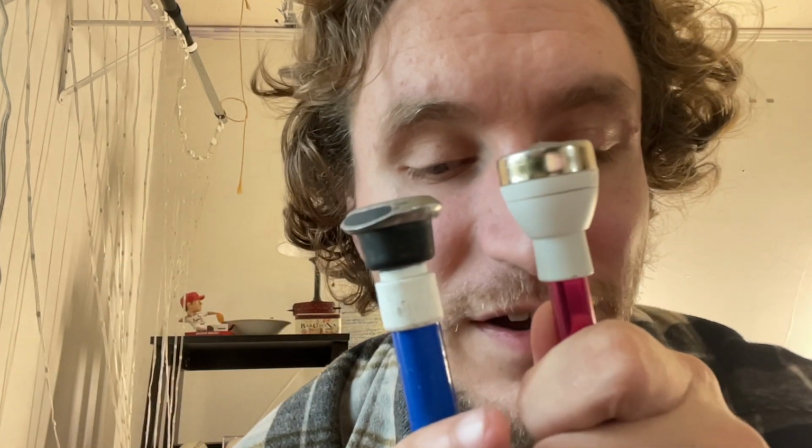So the tip on this cane is the only potential downside. And what's interesting to me is it feels, and maybe looks a little, like the glide tip from the Ambutech. Not exactly, but it's kind of got this disc shape. So the Ambutech cane is on your right-hand side, and the new cane, this collapsible telescoping cane here, is on the left. And what's interesting about this tip specifically is that it rolls. And so it's kind of a cross between a glide and a rolling tip. Now, we're going to get into practicality. If I have it, I am going to, at this time, insert a little bit of test footage.